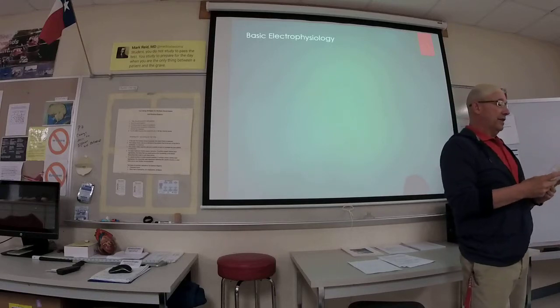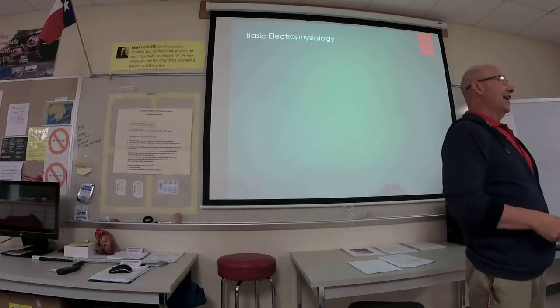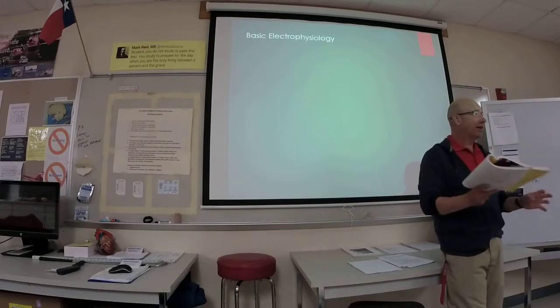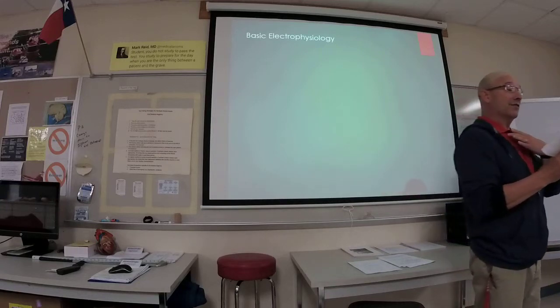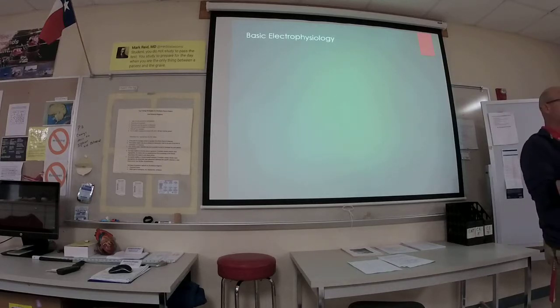It talks about breast implants. I don't think it makes any difference. I've done 12 leads on patients with breast implants before, but PCT-wise, book-wise, it says put V1 and V2 higher, okay, for the breast implants.